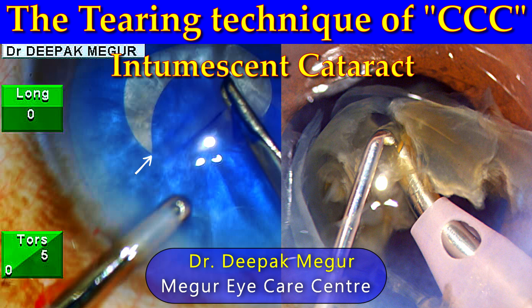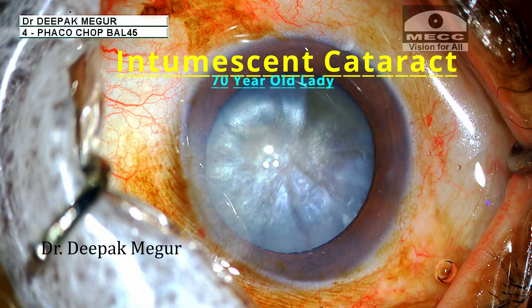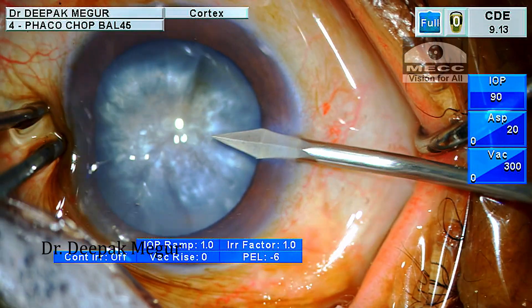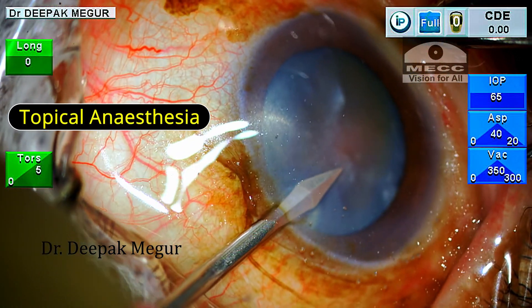Hi friends, this is Dr. Deepak Magur and today's case is yet again an intumescent lens. I begin by performing the side port incisions. The incisions are performed with a nice tunnel which adds great stability to them.